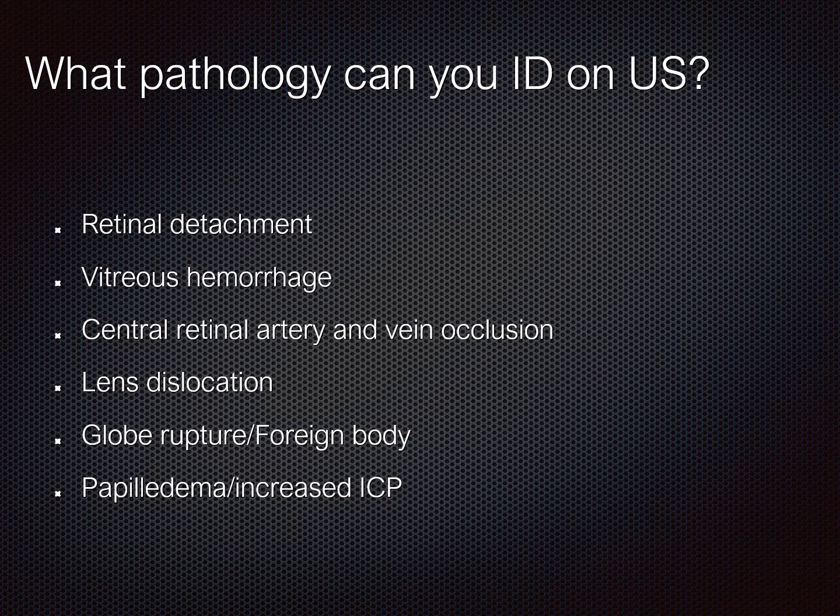And then papilledema or increased ICP. This is something that even if you did do a good fundoscopic exam, could be very difficult to see, and specifically in the ER, the patients where we're really worried about increased ICP are brain bleed, altered mental status patients, where a good dilated exam is not possible. Ultrasound now gives you the ability to evaluate for papilledema and increased ICP on anybody. Anybody whose eyelid can be closed, you can do this study.